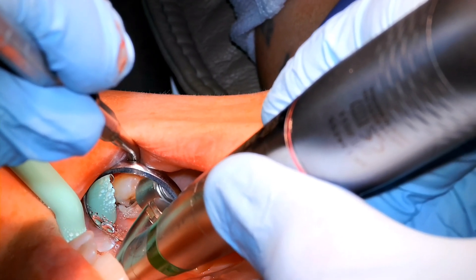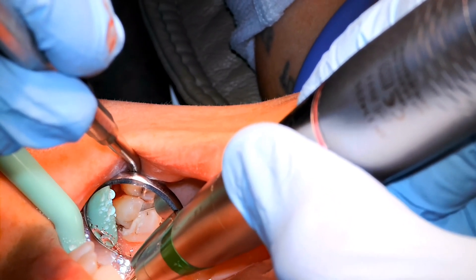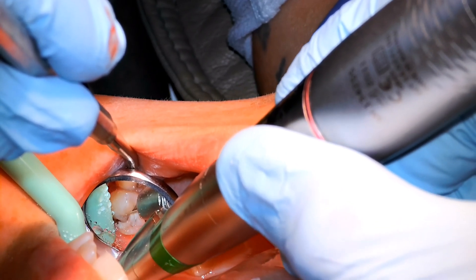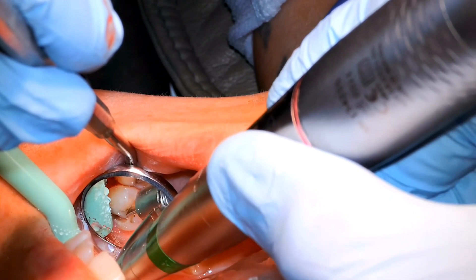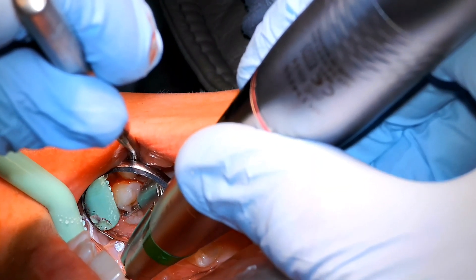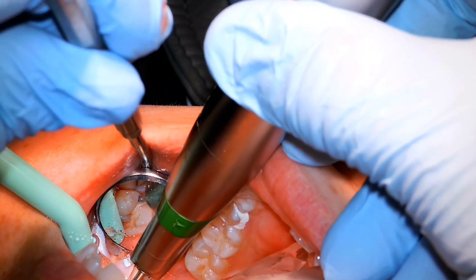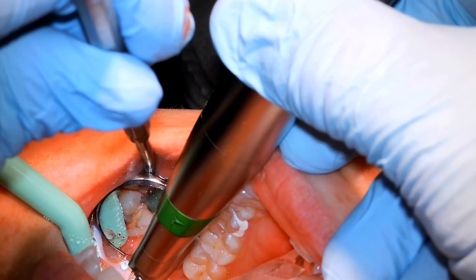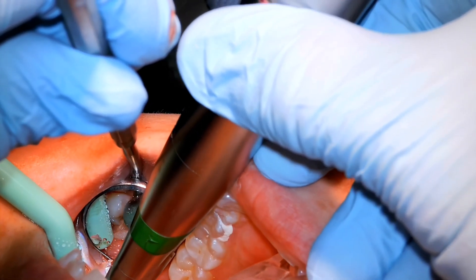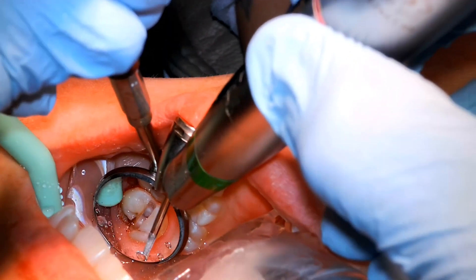I'm cutting mesial to distal using a 702 surgical bur. The 702 is usually fat enough to give a pretty good trough and section apart the roots, but not so big as to completely obliterate the tooth and leave nothing to elevate on. We're making that trough to separate the palatal root from the mesial and distal roots, taking it right down to the furcation to help separate things.